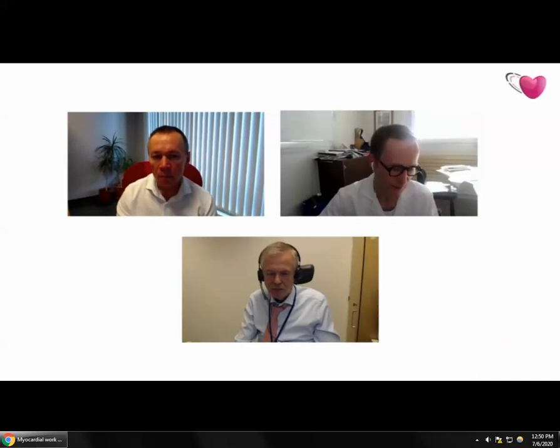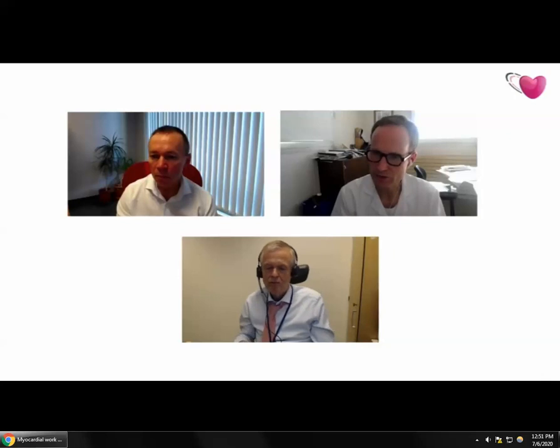Yes, if I may, the constructive work is quite important, but it's not enough. You have the four numbers on the screen, and just below the constructive work you have the wasted work. This wasted work is quite interesting too, because in a DCM patient with chronic heart failure, seeing that you have a lot of wasted work can push you to decide whether or not to implant a CRT device. So it's quite interesting to look at the four parameters. But of course, if you have to look at only one parameter, the global work index is probably the most useful.